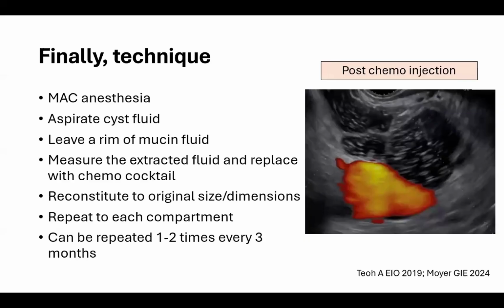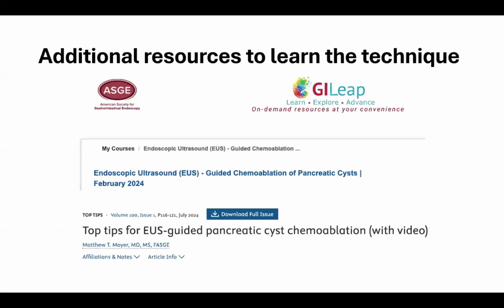And then you want to repeat this in every compartment. You're going to be able to see, as in the figure, where the cocktail is really going. And if you see an area that hasn't really received the treatment, then you want to repeat it during the same session in that area. And then afterwards, you want to follow up patients in 3 months, and it can be repeated at that point 1 or 2 times prospectively.